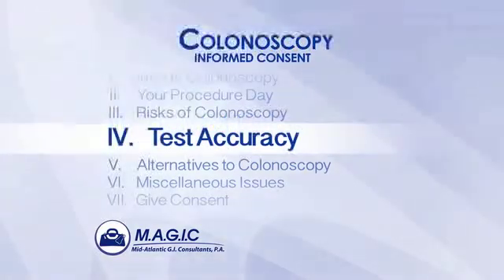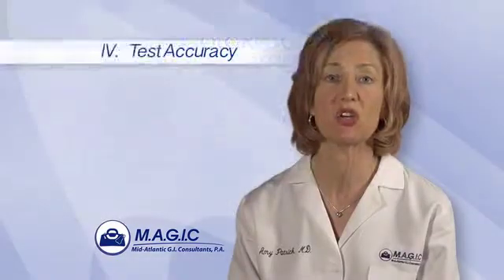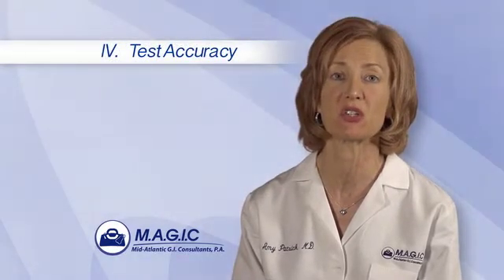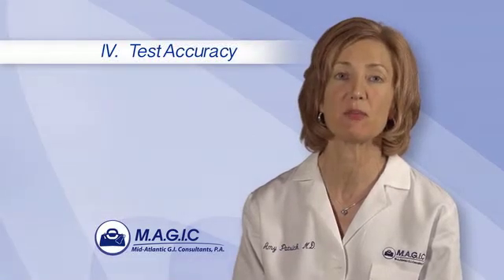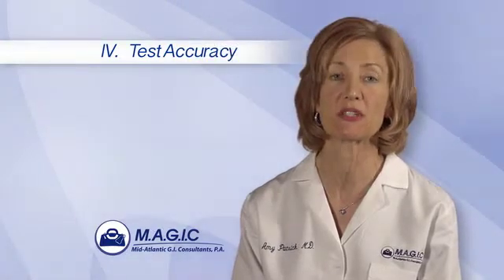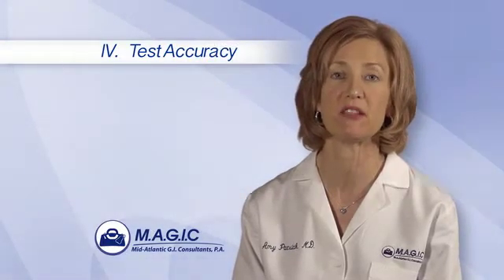Test accuracy. Finally, you need to know that colonoscopy is not a perfect test. Studies show that even in the hands of the most careful, experienced doctor, as many as 10% of important findings may be missed during a colonoscopy. Missed findings may include precancerous polyps, cancers, and other abnormalities.